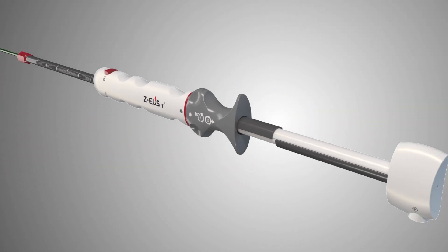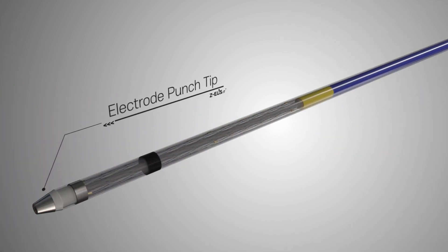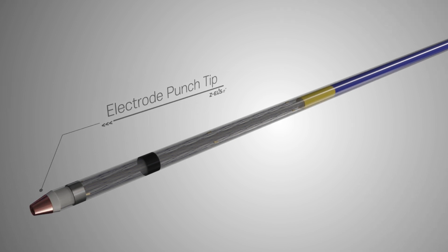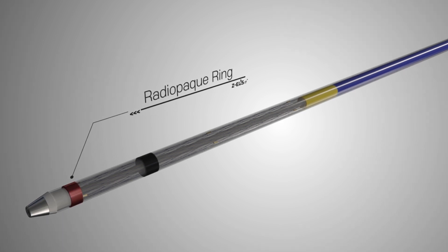The ZEUS-IT handle is designed for easy one-handed operation. The electrode punch tip creates an electric current that allows smooth puncture between two structures. The radiopaque ring aids visualization of stent deployment under fluoroscopic view.